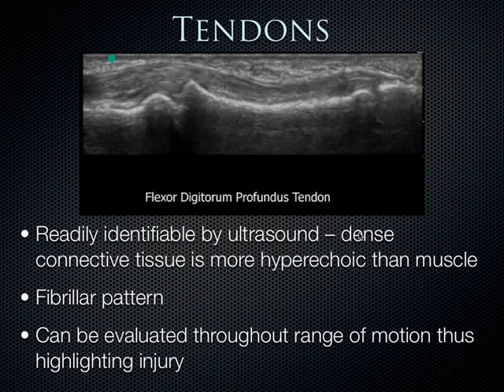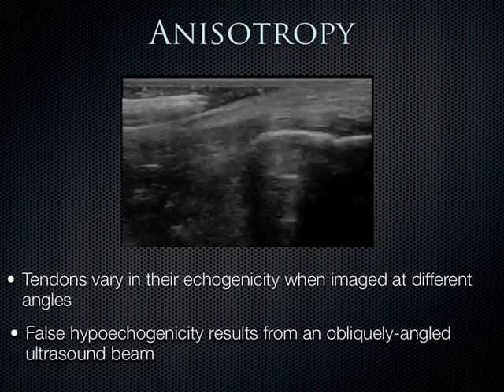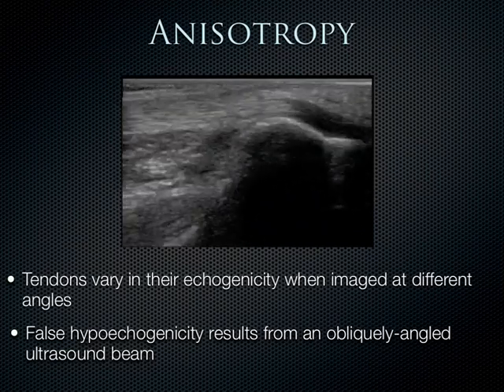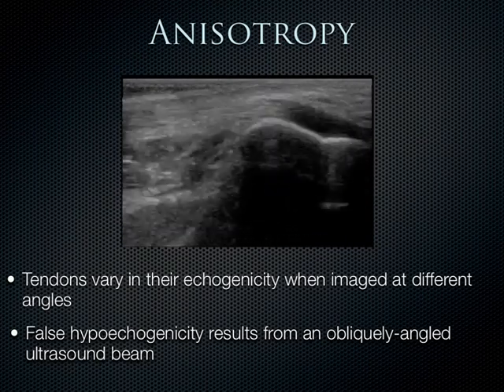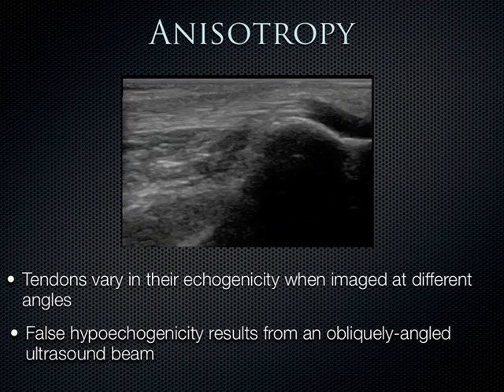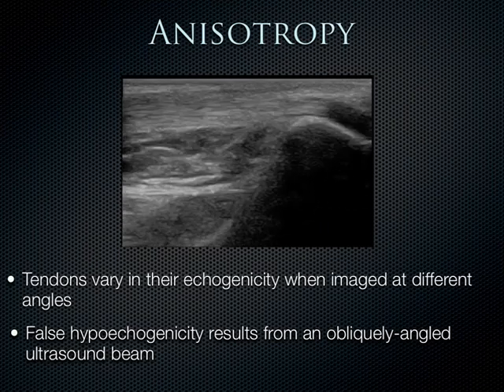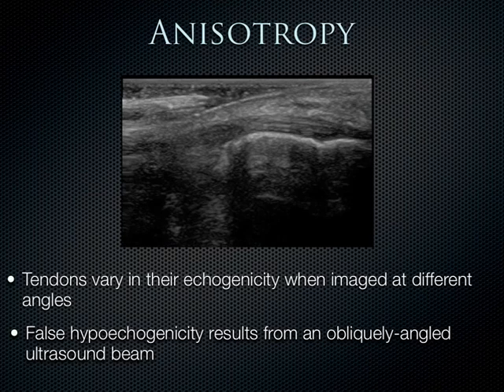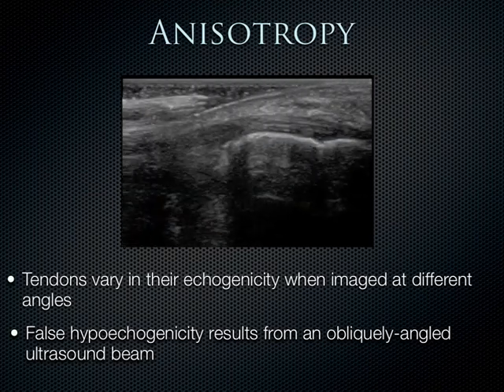Now, if a tendon defect is visualized during this dynamic evaluation, a tendon injury really should be suspected. And there's another concept called anisotropy that you see many times with tendons. I'm going to try to explain it here. Anisotropy is basically tissues that exhibit ultrasound properties that differ according to the direction of the ultrasound imaging. In other words, with muscles and particularly tendons, depending on which angle you insonate them, they can display variable echogenicity.